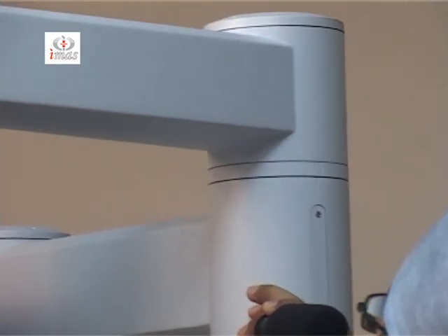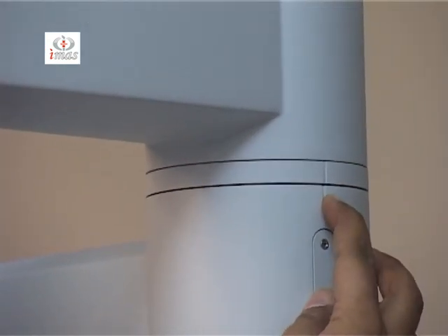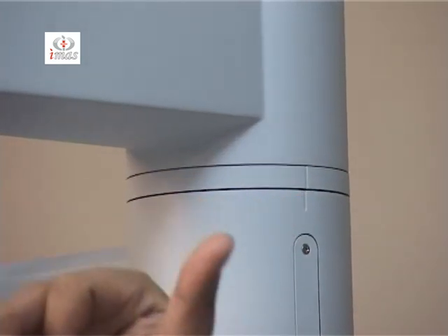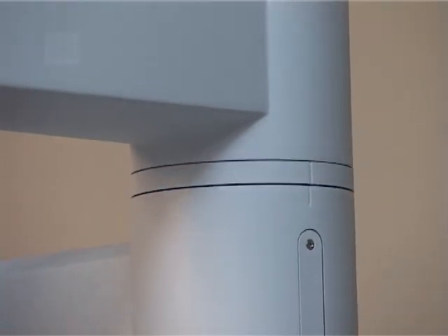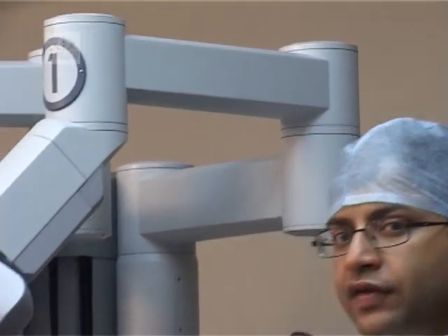These two marks should be matched in order to make it at an angle of 90 degrees, so that the docking is perfect and there is no external arm clashing.